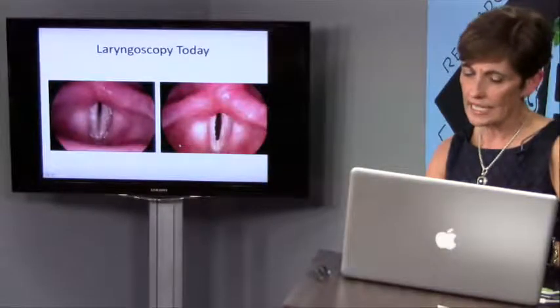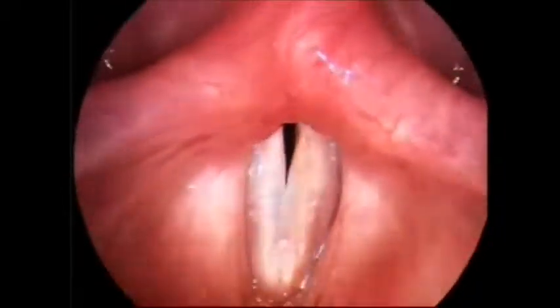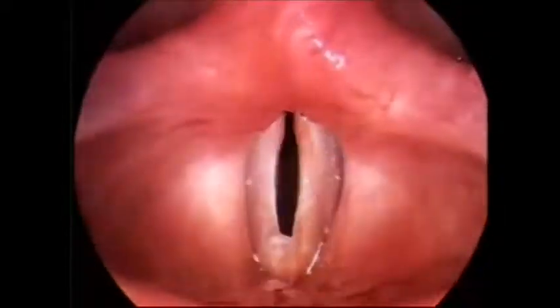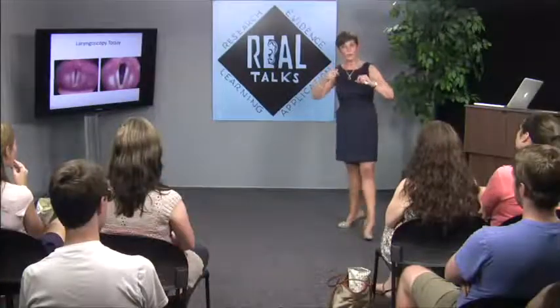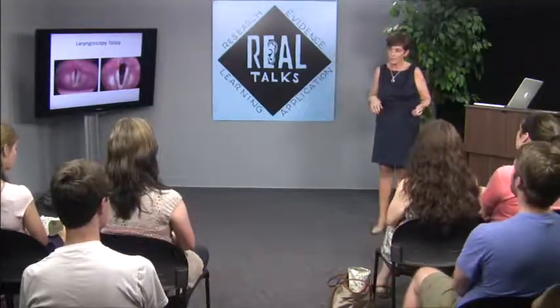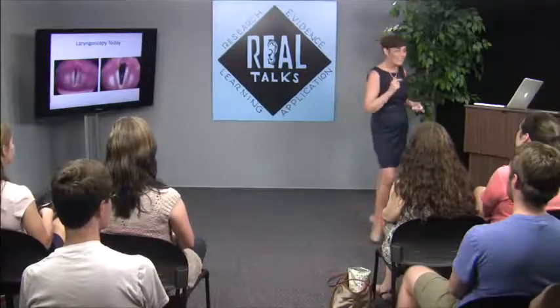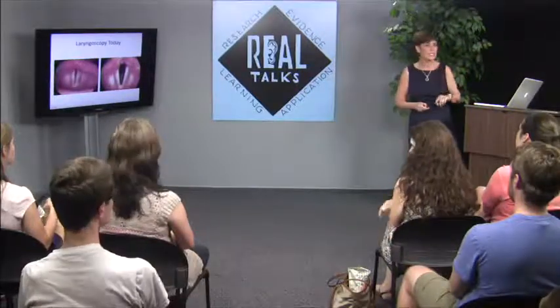So in the early 1990s, a technology called stroboscopy came into being, and video stroboscopy actually is an optical illusion. What it does is it peak picks from cycle to cycle, puts them all together to make you believe you're seeing a constant cycle of vocal fold vibration, and you can see the pliability of the tissue. The key here is that it's an optical illusion. So what you're seeing isn't one cycle. It might be 300 cycles in three seconds of a man holding a note, or 600 cycles in 3 seconds of me holding it. And a little peak is picked from each one of those, put together, and I might see what looks like 3 cycles of vibration. You understand that? So there's some concern that video stroboscopy isn't reality.